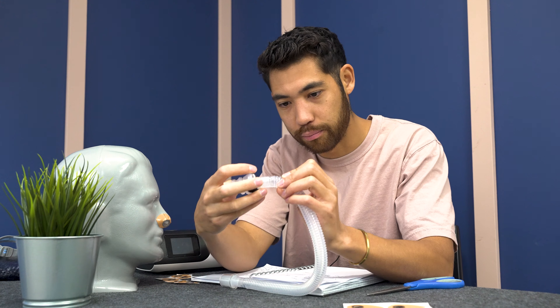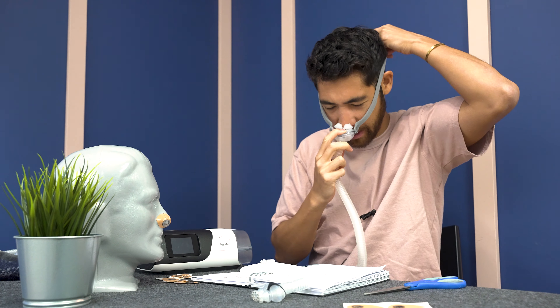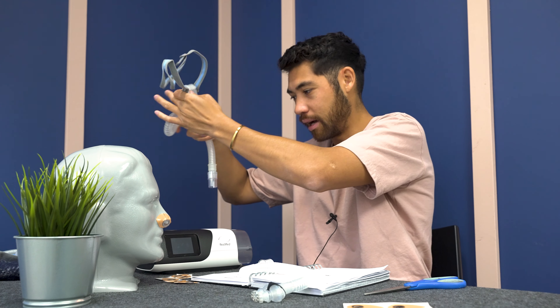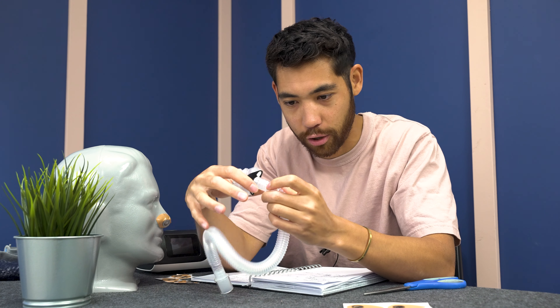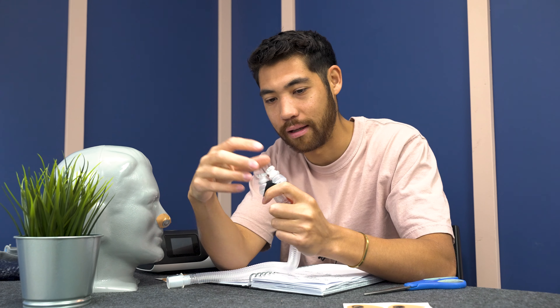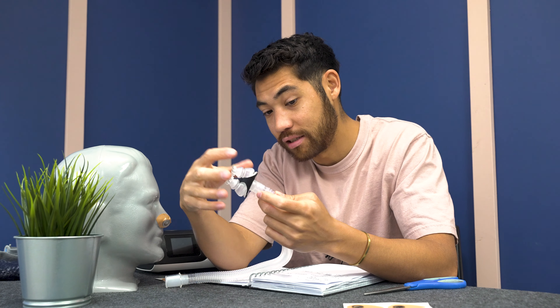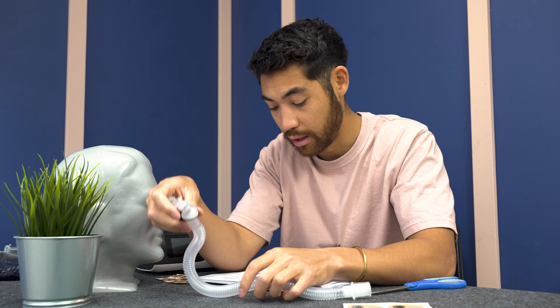The last con I have with this mask is that I broke it — I tore it right here during stress tests. Most other masks, because of the headgear, absorb the shock. But because this sits right on your nose and the magnets are quite strong, I did a couple stress tests and actually tore the tube right here. So if you have a Bleep, make sure you're not standing up and forgetting to take it off. The material does seem a little bit thinner than some competitors, so be careful with your tubes.